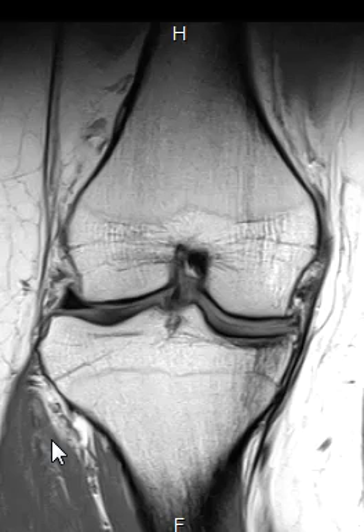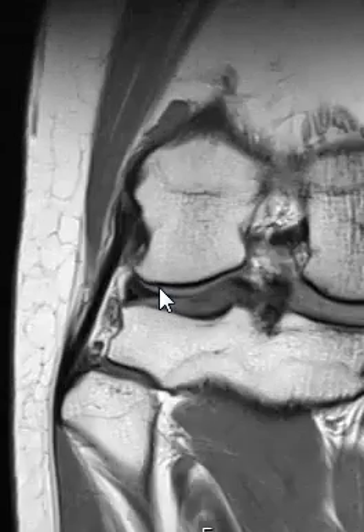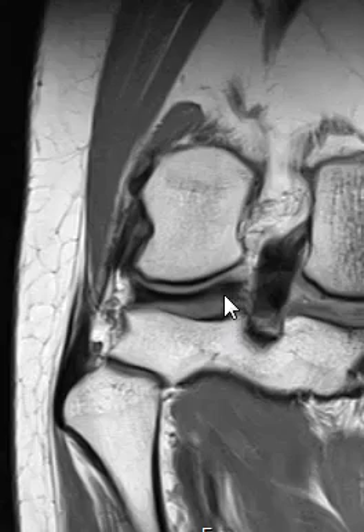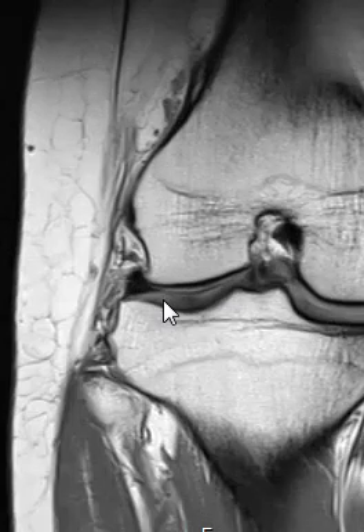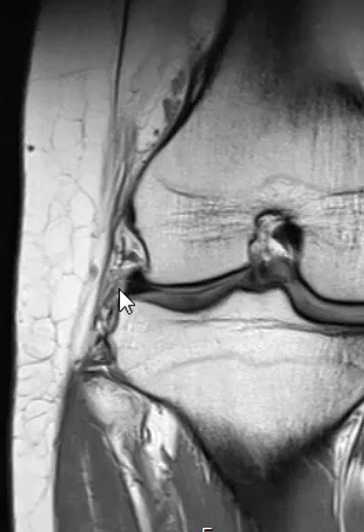If we get back to the center part where you see the tibia and femur, let's look out laterally first. Here laterally we can see this dark wedge — this little dark wedge here is the lateral meniscus. The lateral meniscus is nice and smooth, homogeneous in the back. Coming around to the side and to the front, we see a nice dark, uniform, homogeneous meniscus.